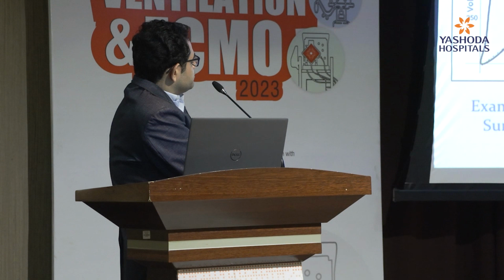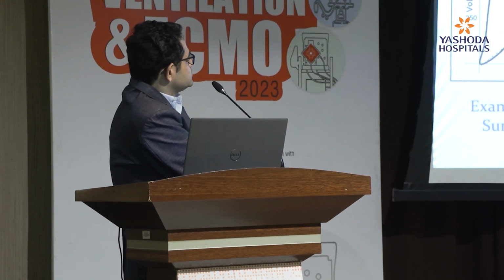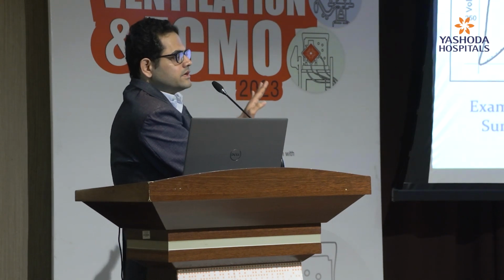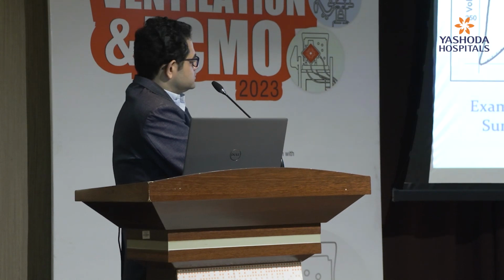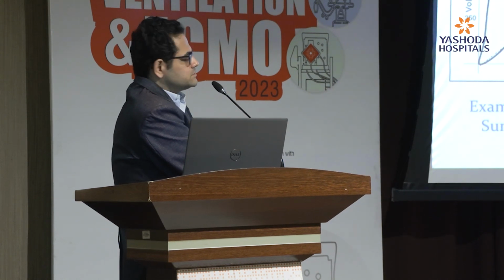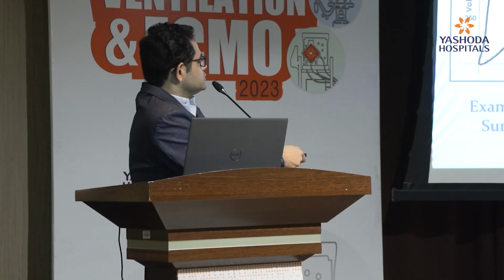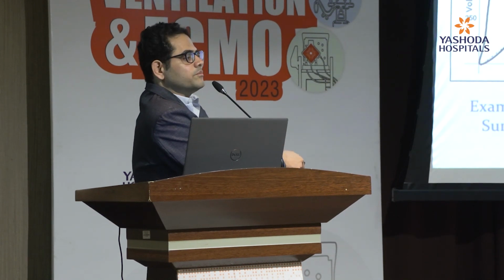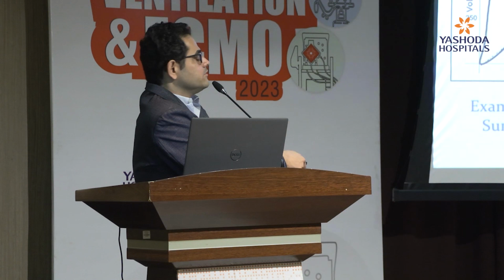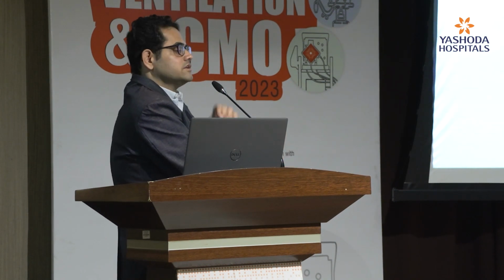So you see the pressures are dropping, pressures are less, and more tidal volume is there. So what will happen? The compliance is better. The system which you are ventilating usually has a better compliance, usually in an emphysematous patient. What is happening here? For a given pressure, there is a drop in the tidal volume. So compliance is dropping. Either the patient will be having ARDS or the patient will be having congestive heart failure.